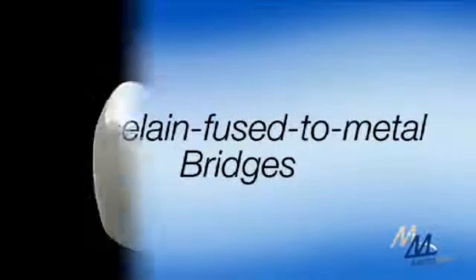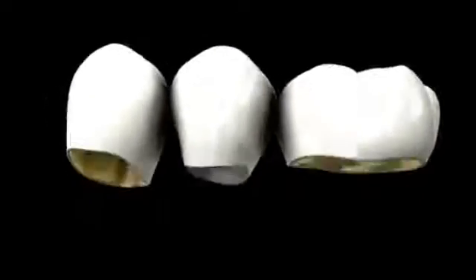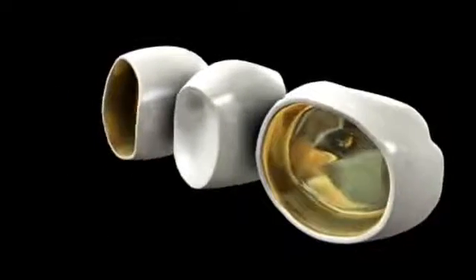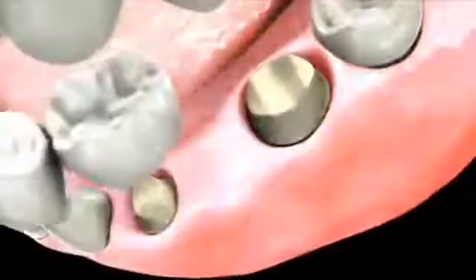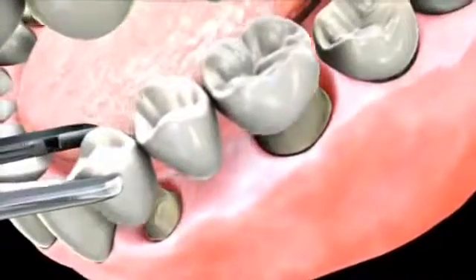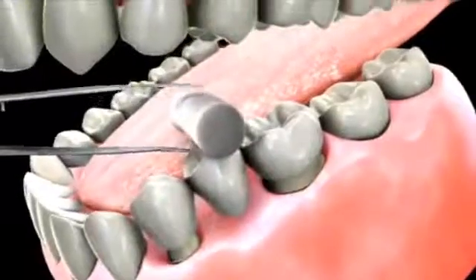The third kind of bridge has a porcelain exterior with a metal framework supporting it underneath. The porcelain gives you the desired aesthetic, and the metal framework provides better structural support, making the porcelain much stronger. This type of porcelain-metal hybrid bridge can be used to replace missing teeth in any area of the mouth, front or back.